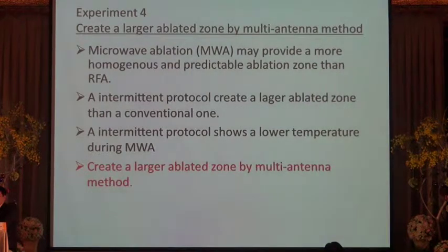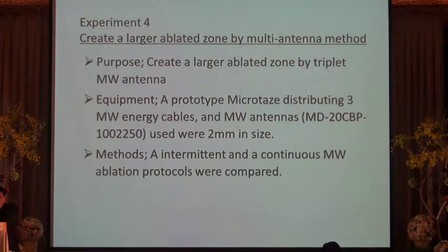And finally, I created a larger ablation with the multi-antenna method. This experiment is a prototype of equipment, so we cannot use it in Japan.